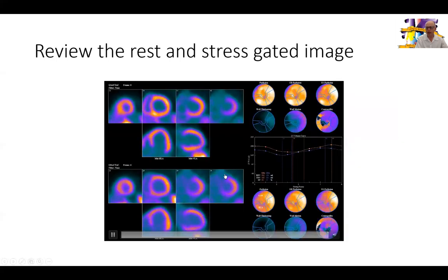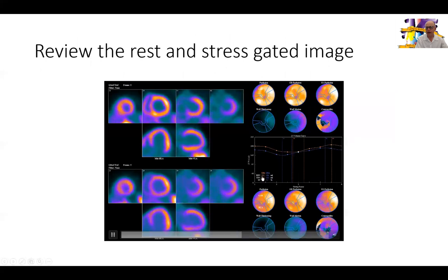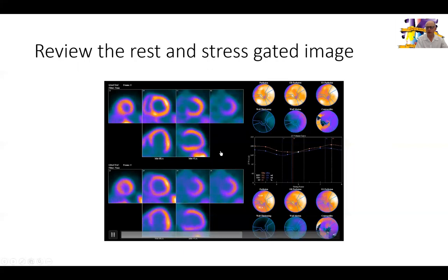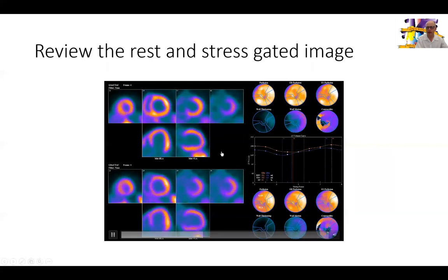Then we go to the gated images. This is a very bad ventricle — ejection fraction is quite reduced, with a very dilated ventricle, in the range of 20%. The right ventricle is also involved, not severely reduced, but there is biventricular dysfunction, more prominent on the left ventricular side than the right.